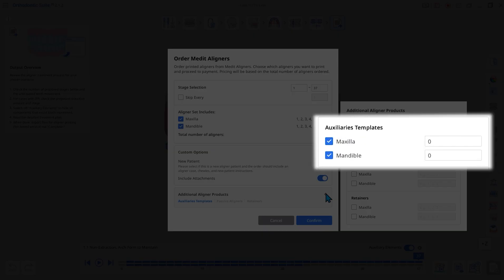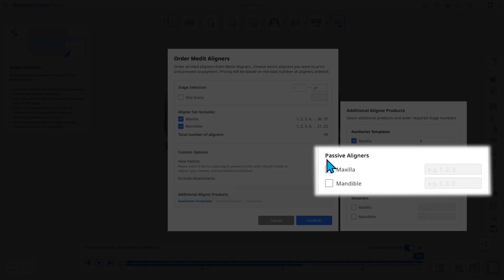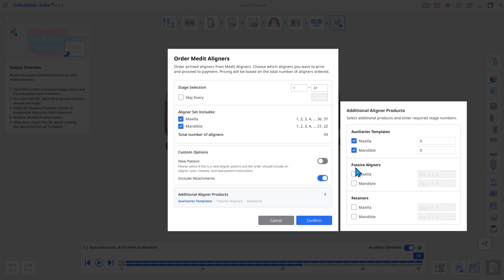Auxiliaries templates allow you to position and place attachments on teeth. Passive aligners maintain teeth in their position and help align the upper and lower arches when the number of aligner stages differs.